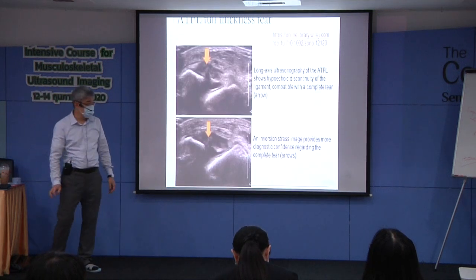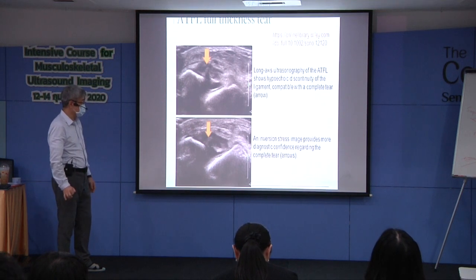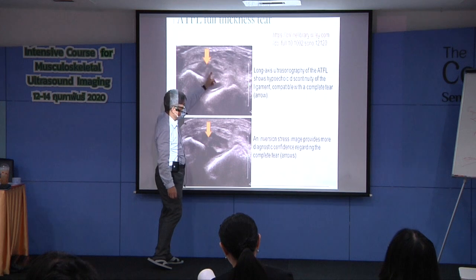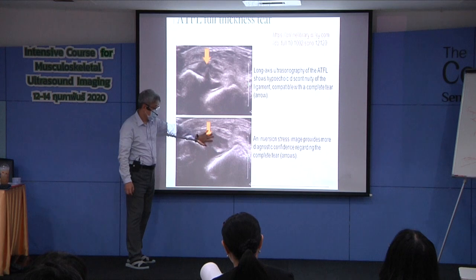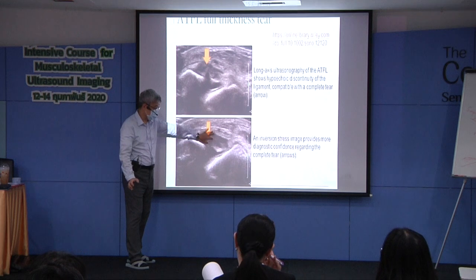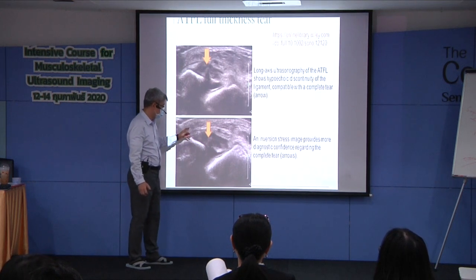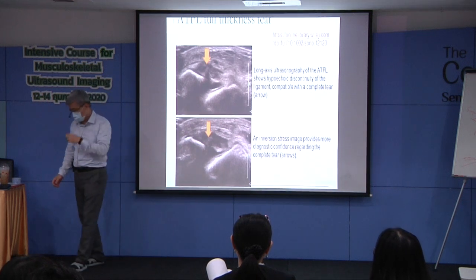There is some knowledge and skill about the joint effusion. I did not have time to explain today, but maybe next time. Okay, long axis, hypoechoic disruptions. It's a ligament tear. The inversion stress test also helps to identify an injured tendon. But for me, as I said in my class, I often use color Doppler or power Doppler to check.